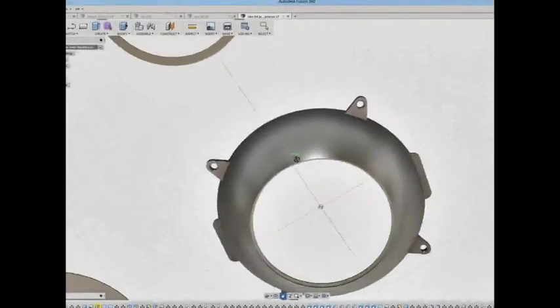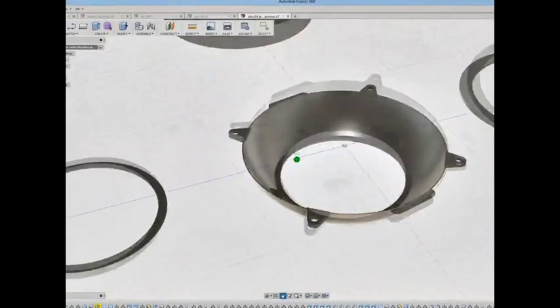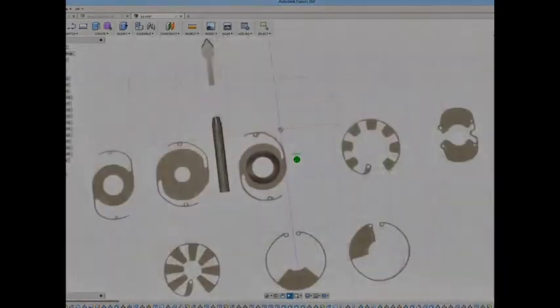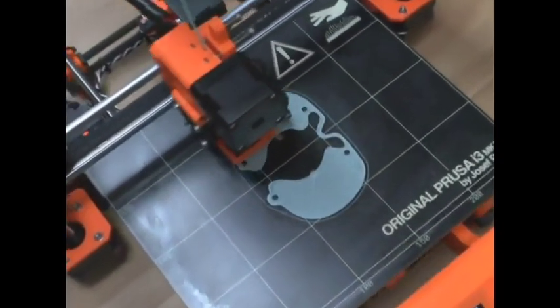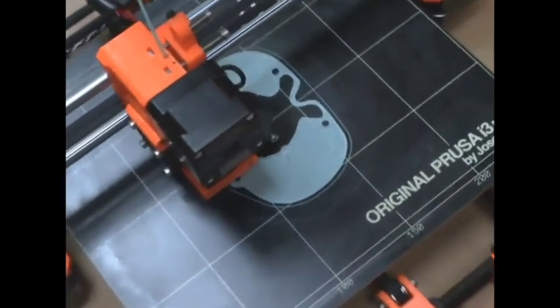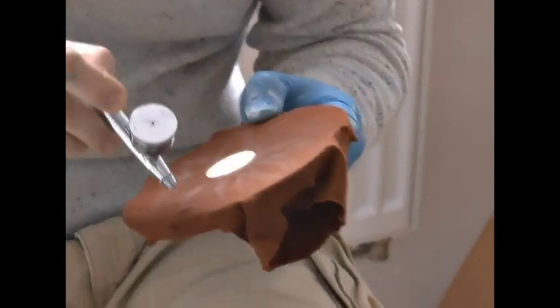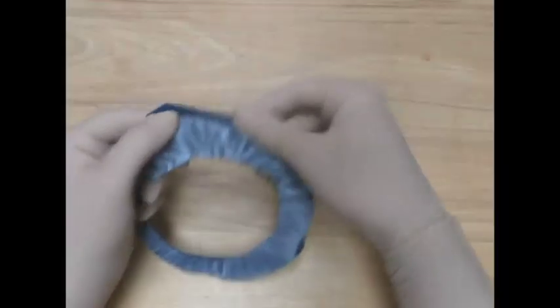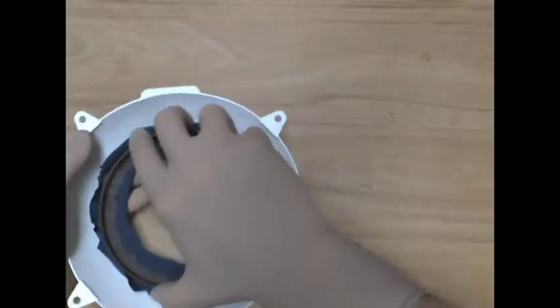We created a 3D model of the ocular anterior segment to demonstrate model examples of surgical techniques dealing with iris reconstruction. This model serves in planning the procedures and in presenting them to patients. The scale of the model is 10 to 1.